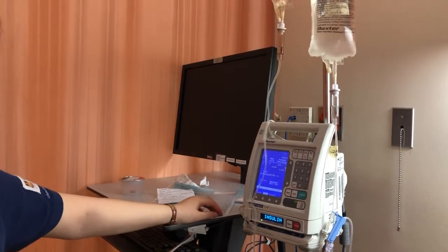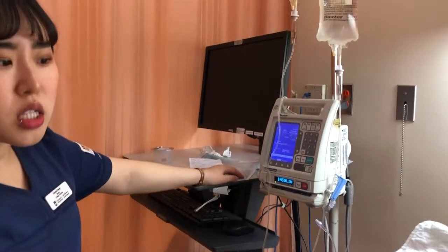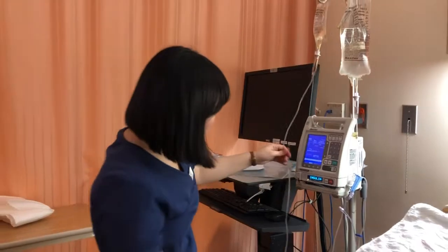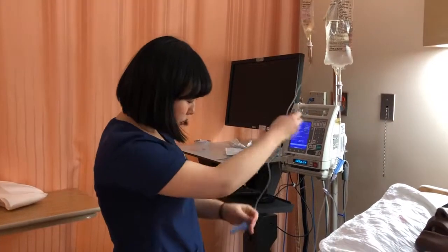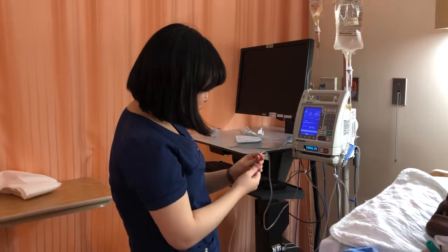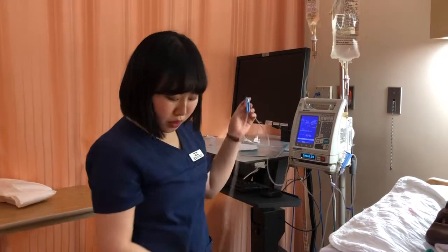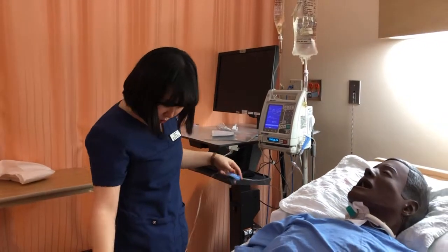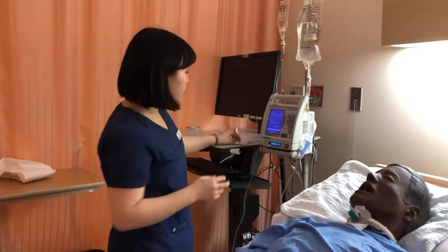So the evaluation is going to be the signs and symptoms of blood sugar. Push pause. So the tubing, I'm going to go ahead and connect the tubing. It's opened, and the clamp is also open, so everything is going well.